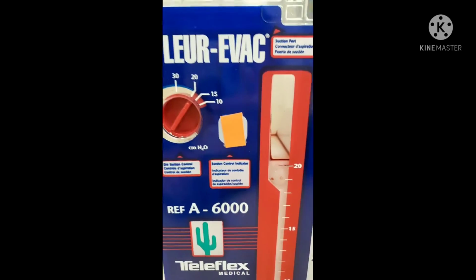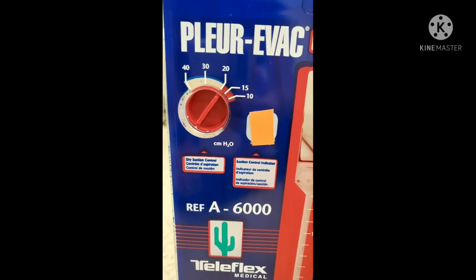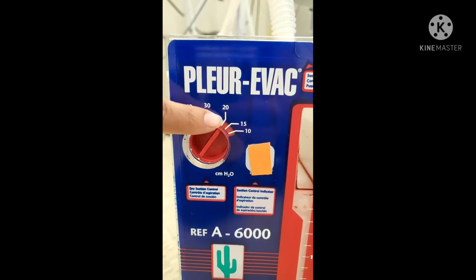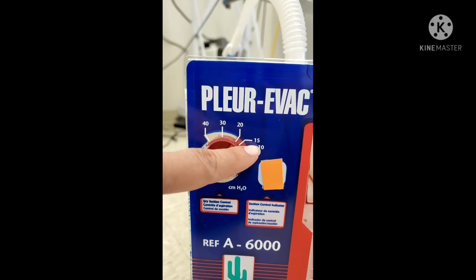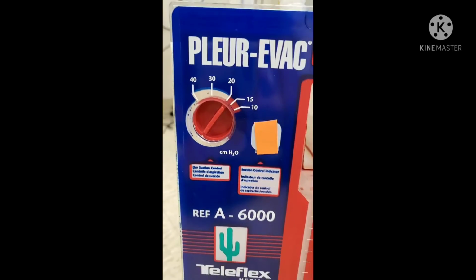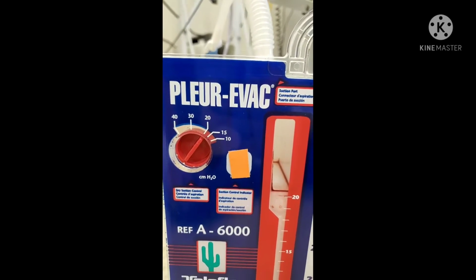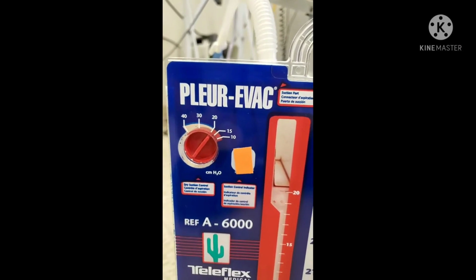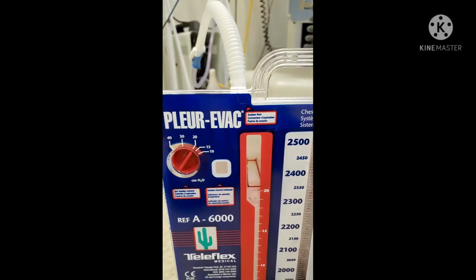And then lastly, we'll just go back over this to give you a nice pure clear picture. The dial is set to 20. Remember, we're looking at our provider's order. Depending on our provider's order, we're going to do 10, 15, 20, or 30. More commonly, I see 20. And we're making sure that our orange bellow is there to show us that, yes, this is working. I just wanted to show you what it looks like if the orange bellow is not there.